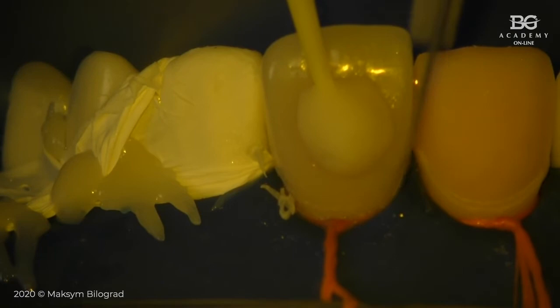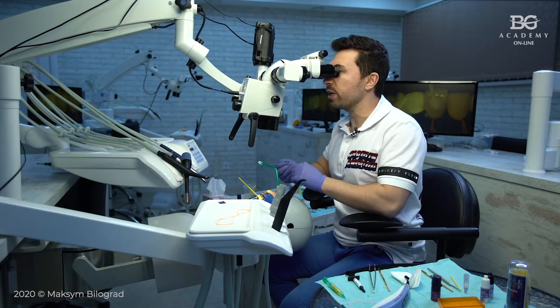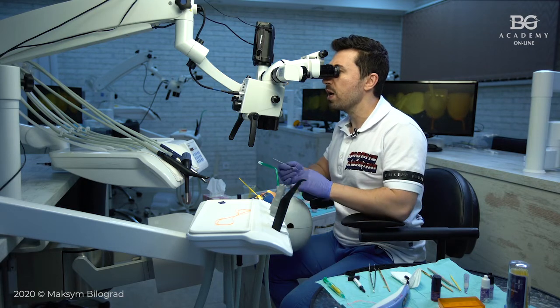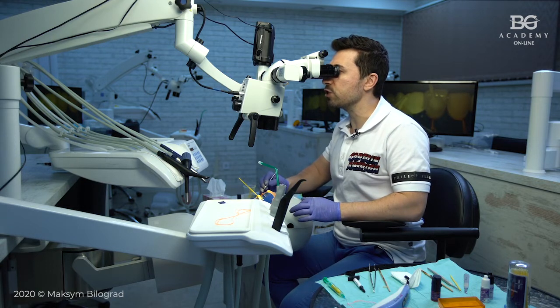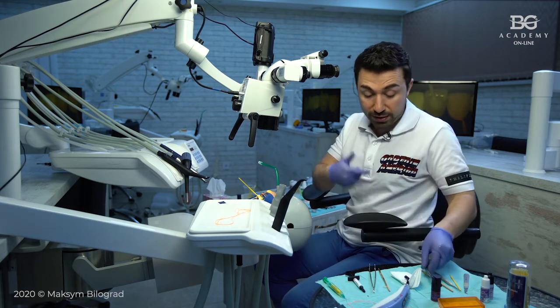There is another thing which is also important and practical. Let us assume that in our case we had some bad fit of veneer here, a small gap, a really small imperfection. So when I light cured the veneer from palatal side and there is an excess of material here, I will not take it out with the scalpel blade.